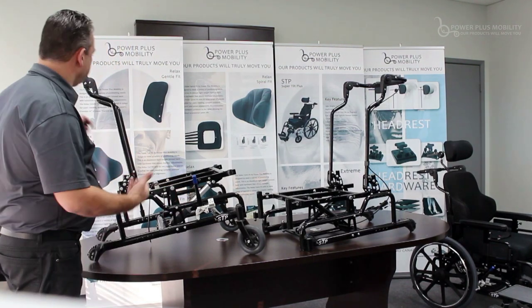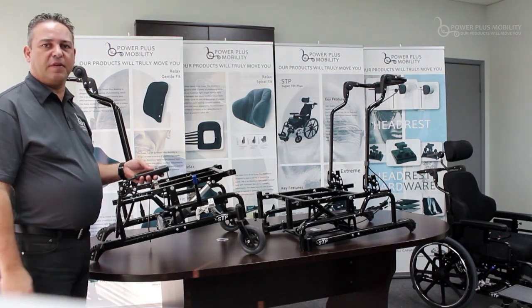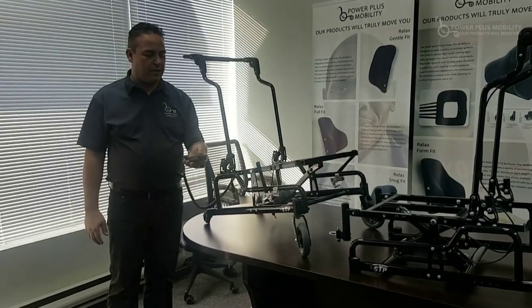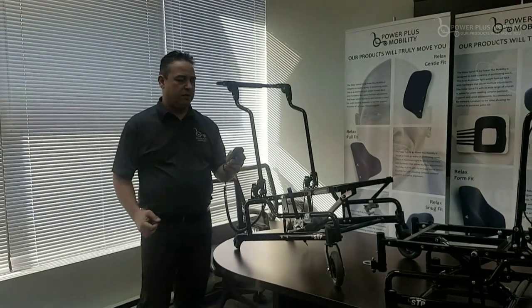What the power tilt does is it allows for the end user to tilt the chair from 0 to 55 degrees on their own with a pendant, such as this here. If I push up, it'll tilt up. If I push down, it'll tilt down.